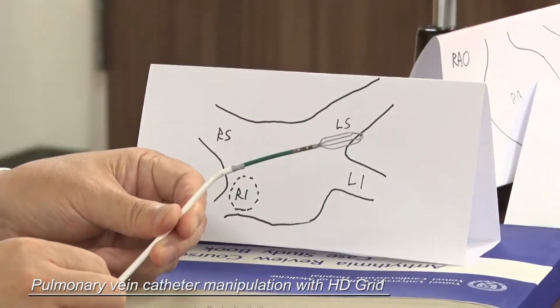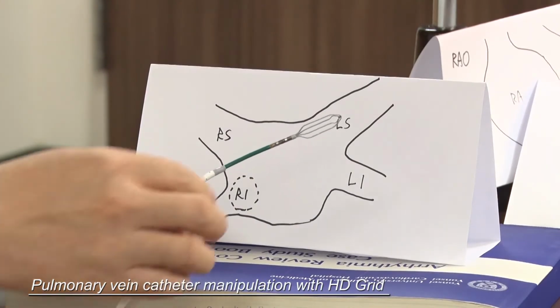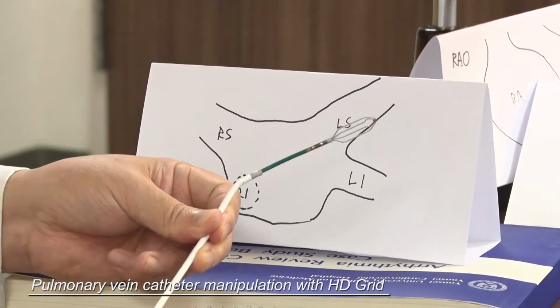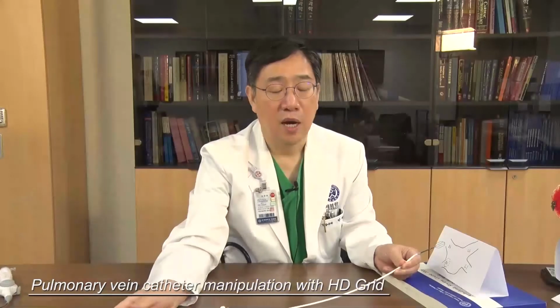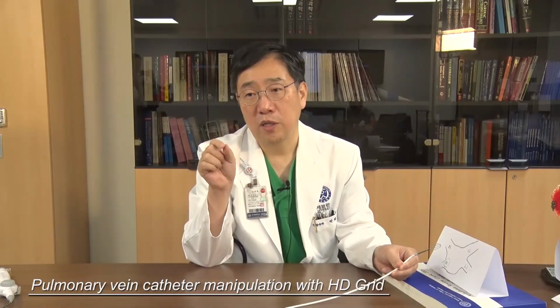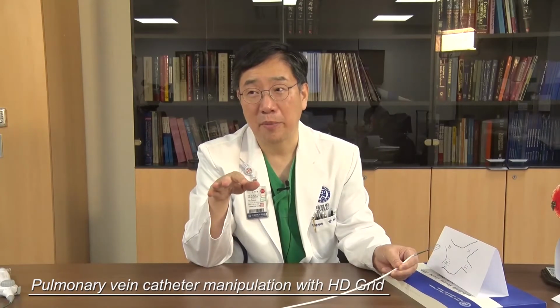So always try to gently apply clockwise torque and push the catheter, and you can put your catheter inside the left side pulmonary vein. Another tip is to watch the electrogram signal. Appendage signal is broader and has big amplitude. If you see the broader, big amplitude signal, you should not push the catheter. It is the appendage, not the left upper pulmonary vein.